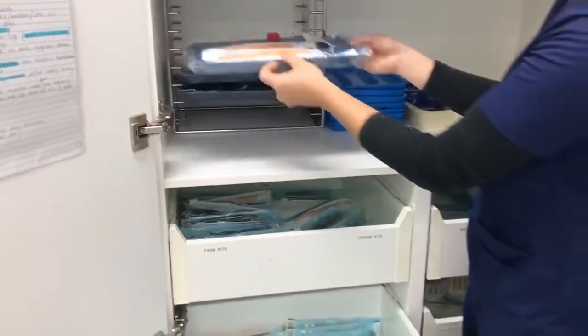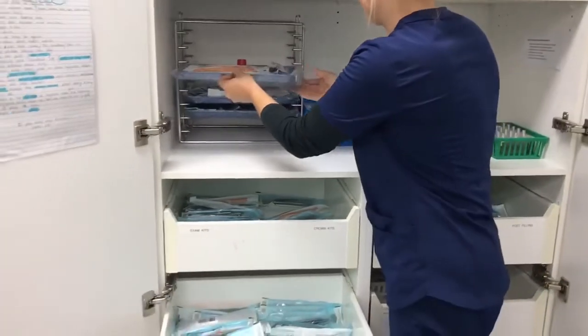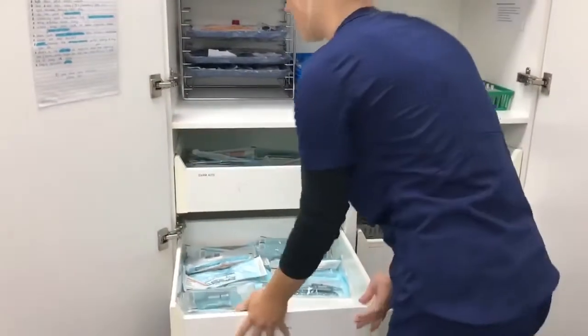These trays can be prepared at the end of each day for the following day, and throughout the day when needed.